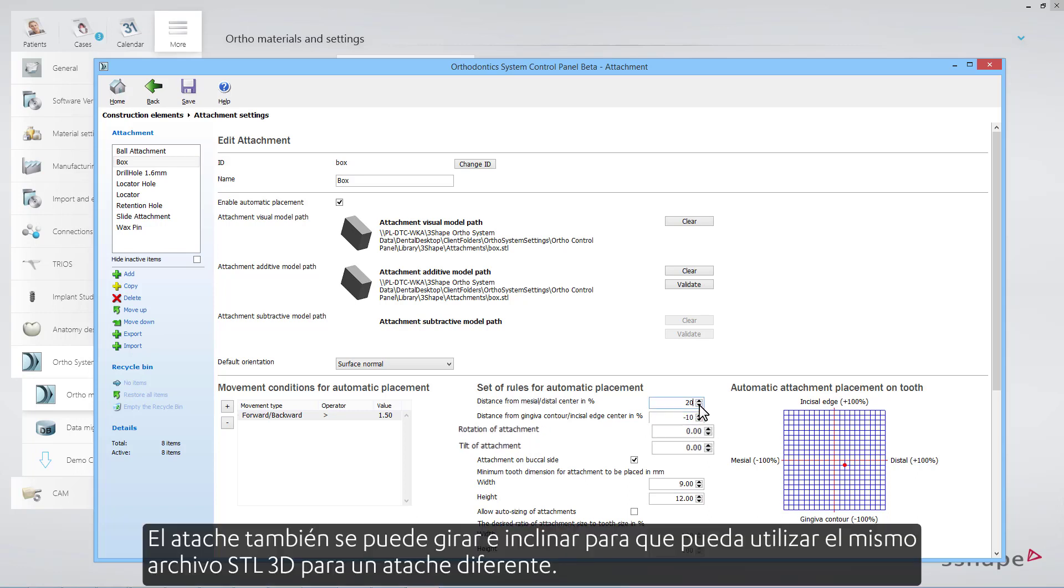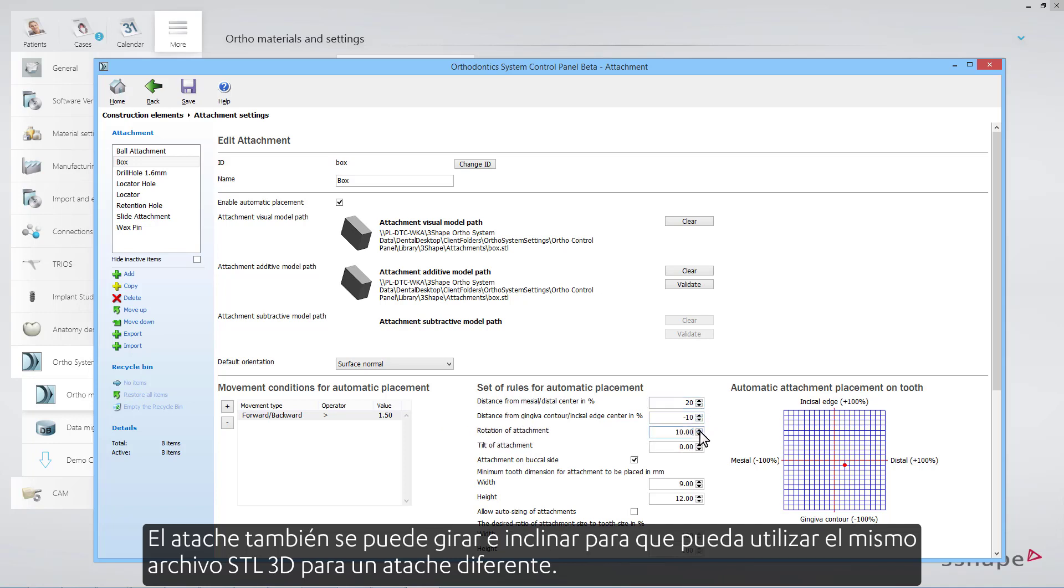The attachment can also be rotated and tilted, so you can use the same 3D STL file for a different attachment.